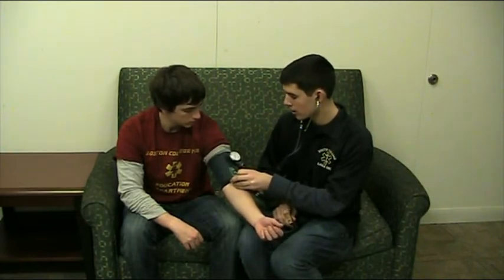Once you've done so, release the bulb. When you hear the first beat in the stethoscope, that is the systolic blood pressure. When you no longer hear the beat, where the needle is, is your diastolic blood pressure. Remove the BP cuff and you have successfully determined a patient's blood pressure.